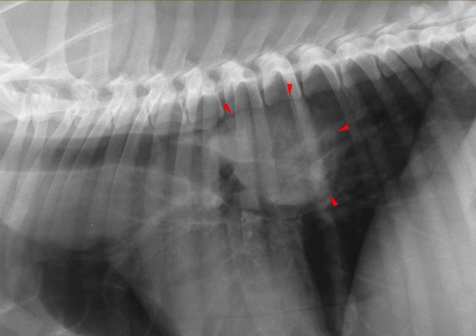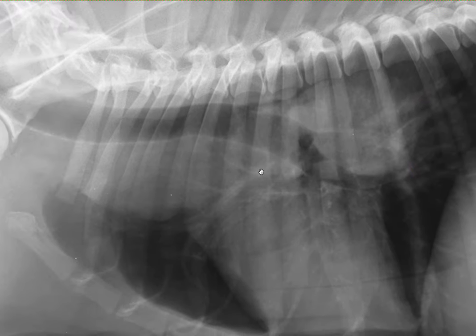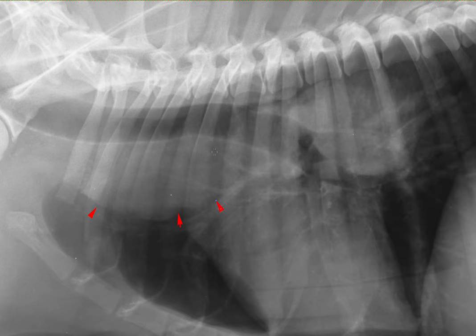Now, if we go back to the lateral view, you may have noticed another soft tissue opacity, in this case ventral to the trachea and cranial to the heart. This is also creating a mass effect. You can see the trachea is pushed in a dorsal direction.